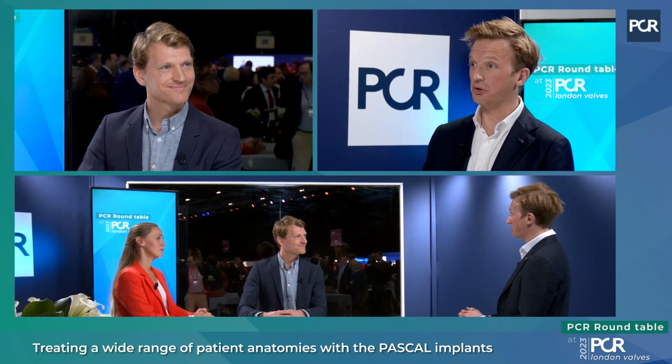Yeah, I completely agree with that. I think what I've found is that the P10, although it's a broader device, and you would think would generate more of a gradient, it actually doesn't. You have a bigger orifice area with that device. In my center, we have quite a simple rule. If there's too much tissue, we generally use an ACE, so that's most degenerative pathology. And if there's too little tissue, we generally turn towards the P10, because having a spacer means you put the leaflets under less tension, and I think probably get a more predictable result. So that's our algorithm. So it's interesting to hear how we're all broadly the same, but we have a few differences in our practice.